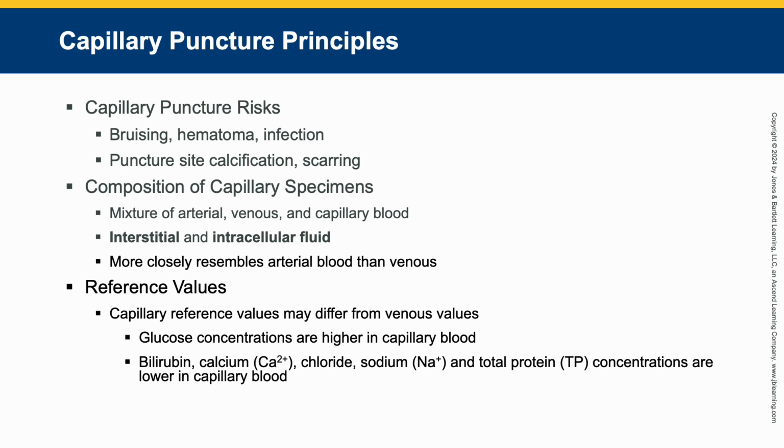One other thing to keep in mind is that if you don't wipe off that first drop and then collect the rest, if you are doing a potassium, it may be falsely elevated if there is tissue fluid contamination or if you have a hemolyzed capillary specimen.